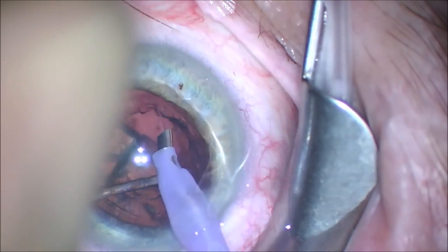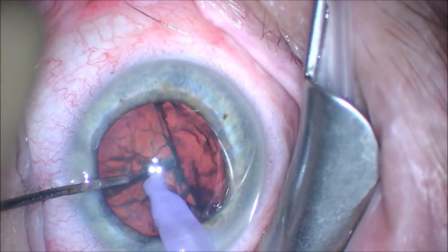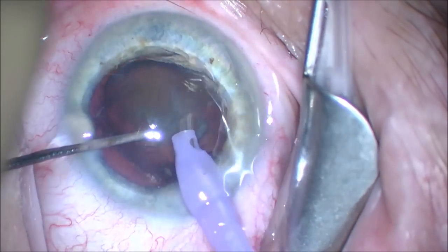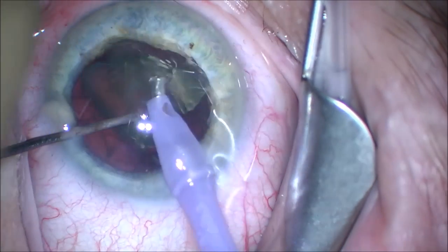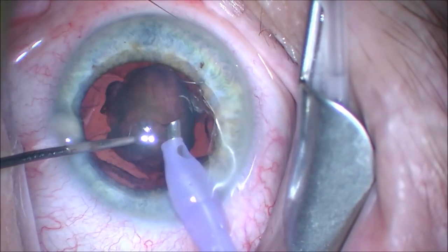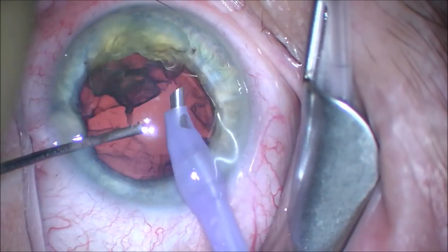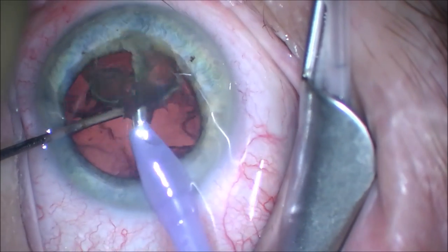This leaves us with a hemi nucleus, or half the cataract, to remove. We again remove this in burst mode, and you can see the piece of the cataract comes up very quickly. In fact, both the third and fourth pieces are still attached and they come out as a unit. You can see we're left here with the last piece of the cataract, and we emulsify this very quickly using the burst mode and high vacuum.